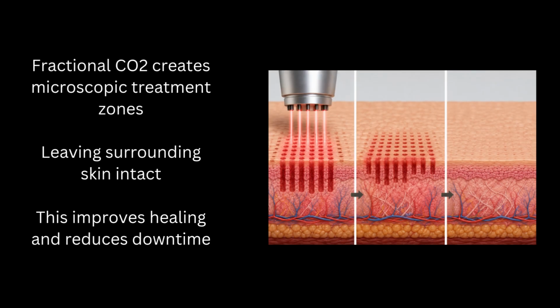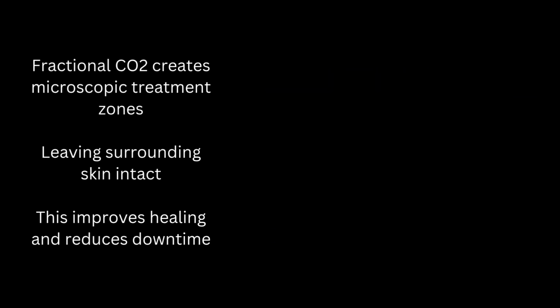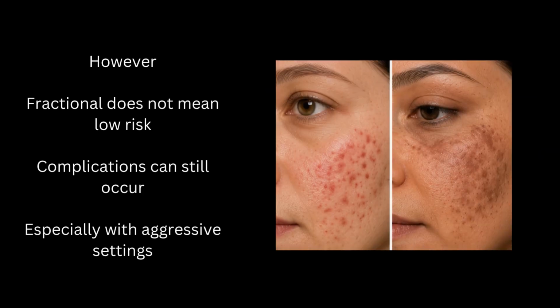Fractional CO2 creates microscopic treatment zones, leaving surrounding skin intact. This improves healing and reduces downtime. However, fractional does not mean low risk. Complications can still occur, especially with aggressive settings.